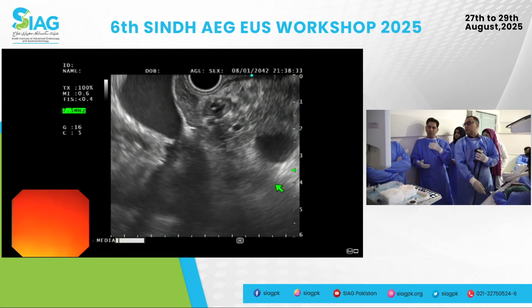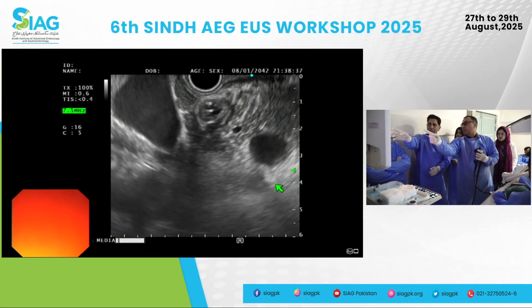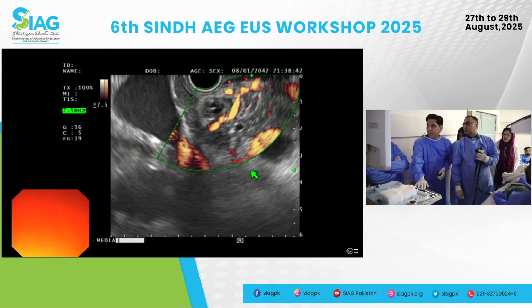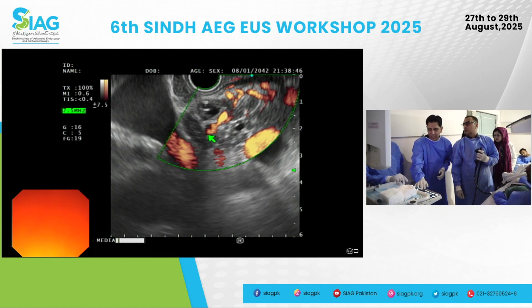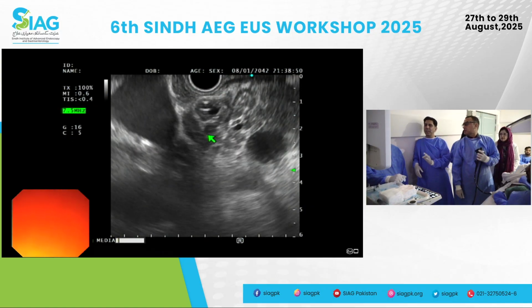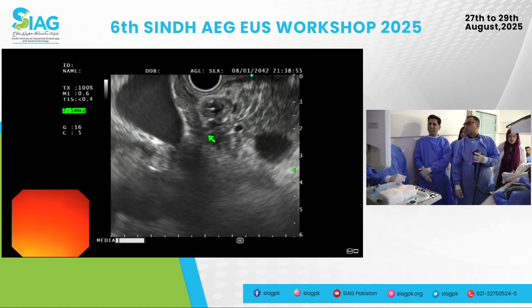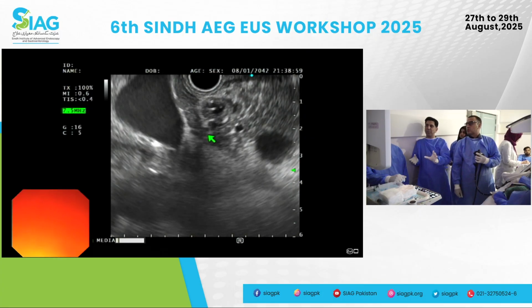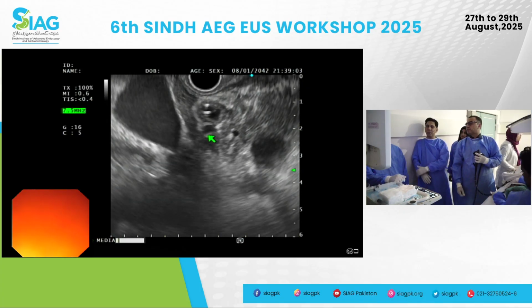So if you're going from the GOJ into the stomach, or from the stomach into the duodenum, then yes, okay. So, PD. Is that PD? Okay, so portal vein, PD, and CBD with a stent. Just to mention, when we were in the stomach, the pancreatic parenchyma was unremarkable. There was slight coarseness, but apart from this, no focal mass lesion seen. And the PD was not dilated peripheral to the suspected stricture in the distal CBD. So again, to some extent, that was reassuring.